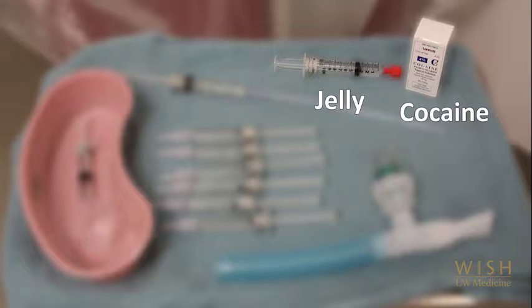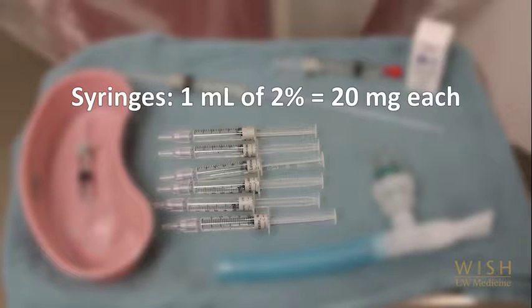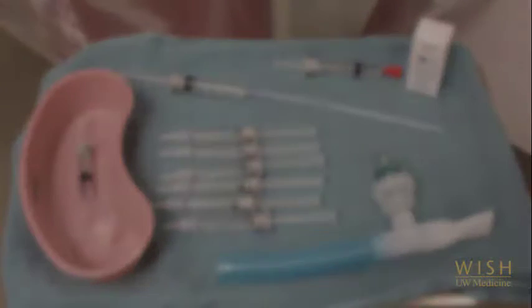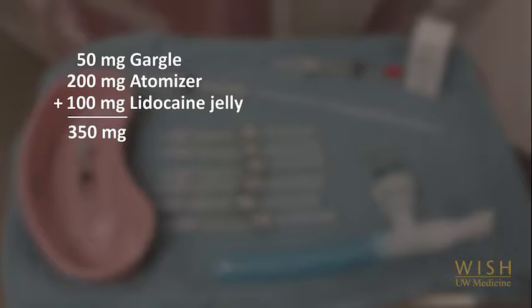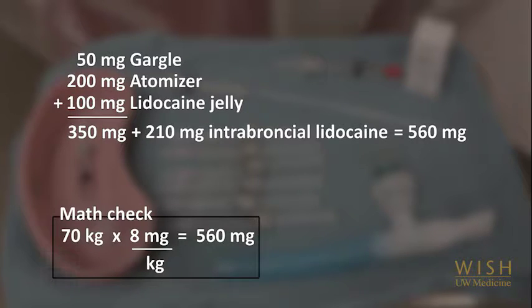Cocaine or lidocaine jelly is applied to the naris using cotton swabs. Typically, we try to insert a total of 4 cotton swabs, 1 or 2 at a time. 5 ml of 2% lidocaine jelly contains 100 mg and is used to apply to the naris via cotton swabs and to the end of the bronchoscope. The syringes each contain 20 mg — that is 1 ml of 2% lidocaine — to be given through the bronchoscope. The plunger is pulled out so that the rest of the syringe is filled with air to ensure the lidocaine passes through the working channel. For the average 70 kg man: 50 mg as a gargle, 200 mg in the atomizer, and 100 mg as lidocaine jelly — a total of 350 mg prior to bronchoscopy — leaving 210 mg, or 10 bolus doses, available during the procedure to reach a maximum of 560 mg, which is 8 mg per kg. The total dose of lidocaine given should be recorded in the bronchoscopy note.